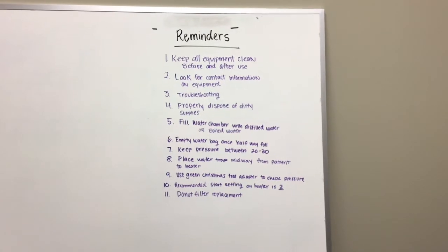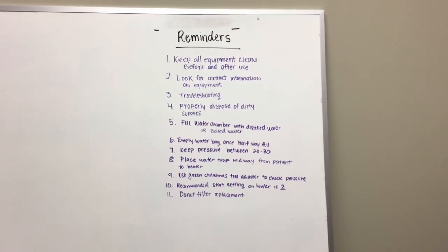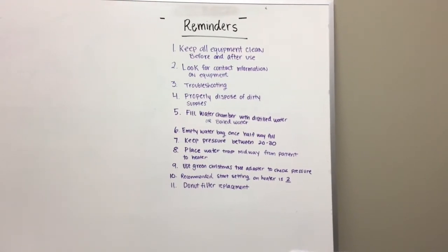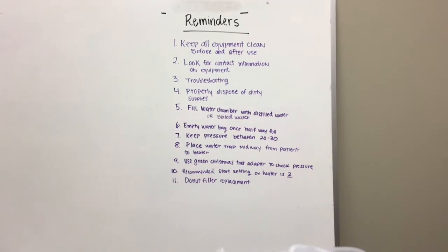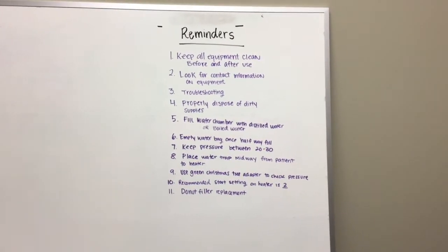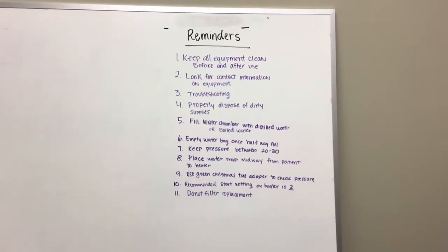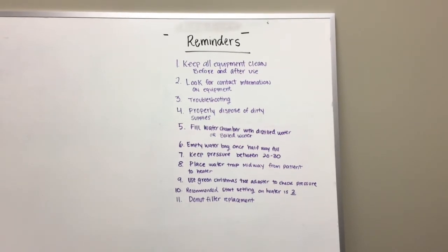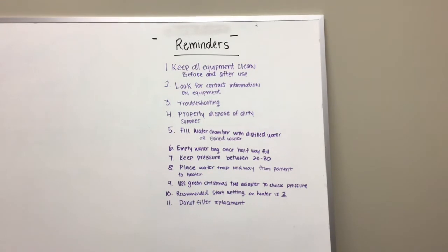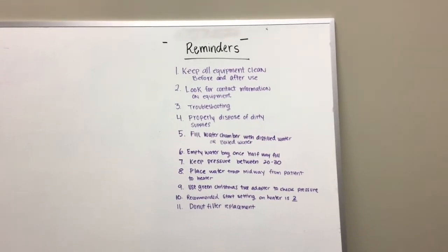Remember to place your water trap midway from your patient to your heater, allowing your corrugated tubing to be able to trap your water. Use your green Christmas tree adapter to check your pressure. Your recommended start setting on your heater is 2. This can be adjusted for patient's needs. If your donut filter needs to be replaced, feel free to reach out to let us know and we can have one shipped to you.